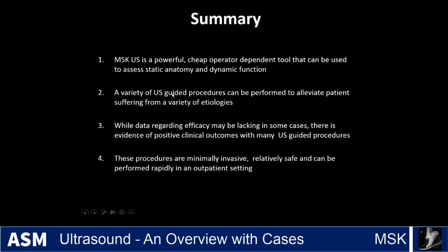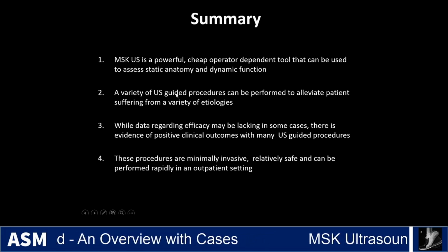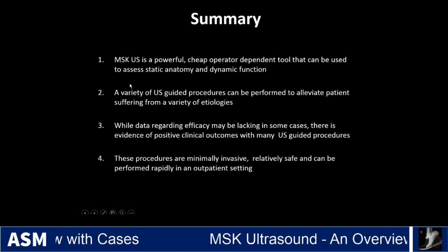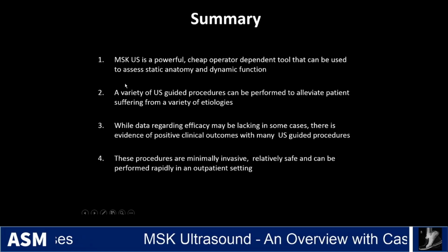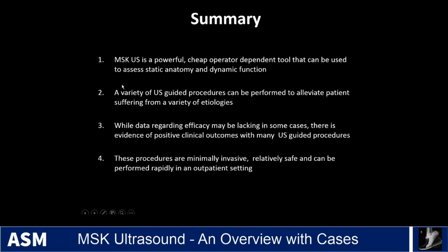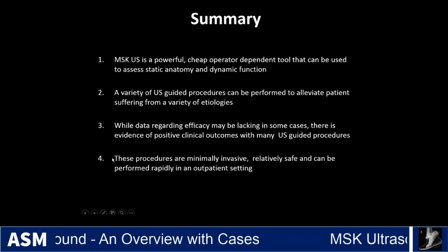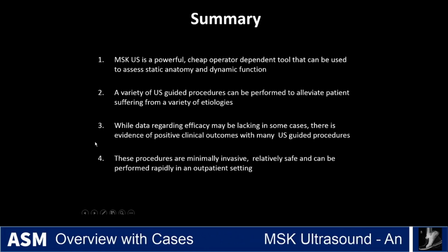A variety of ultrasound-guided procedures can be performed to help alleviate patient suffering, and it's important to look at the body of evidence for doing these procedures before you decide to do those in your practice, because it's a work in progress and is constantly evolving. So just make sure that you are staying up to date with the evidence for what you're doing. And then these procedures, they're minimally invasive, relatively safe, and can be performed rapidly in an outpatient setting.